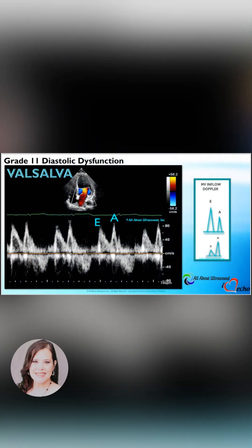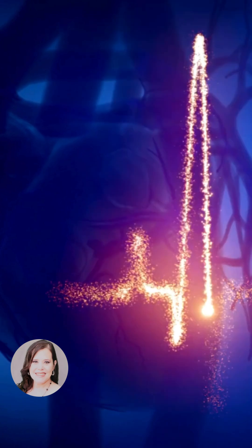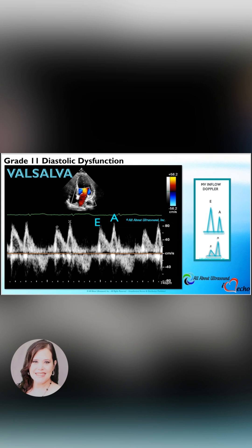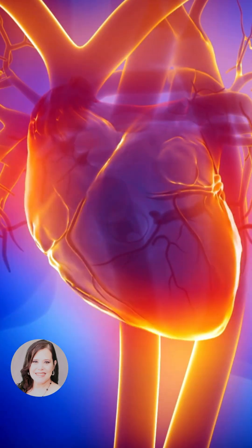The increased filling pressures can be observed upon utilization of the Valsalva maneuver. The maneuver is effective if you see a rise in heart rate, and you may also see a decrease in the overall velocity. The Valsalva maneuver increases the intrathoracic pressure and reduces the venous return to the atrium, which unloads the ventricle and causes a drop in filling pressure.